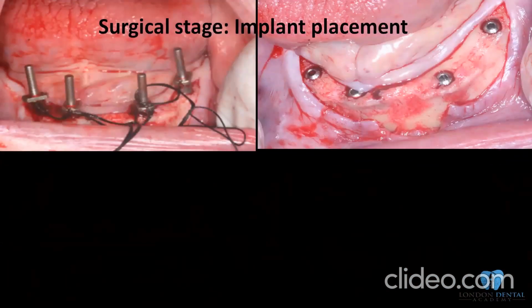So I decided to do this. This is a lady who I think was in her late 70s. Now, I'm not going for all-on-4, and it isn't intended to talk about all-on-4 in these cases, but rather to put a plan.